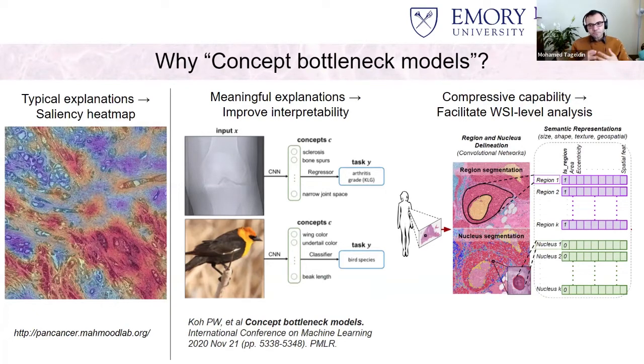But also, it's quite subjective. It's hard to know what really matters, and it's hard to know how to translate what pathologists subjectively consider when they're making these calls, when they're saying this is cancer because it has prominent nucleoli and it looks ugly and it has a feel that it's a cancer nucleus, or that there's variability in the tubule formation. A lot of these things, it's not immediately apparent that you can translate them to things you can detect yourself and be sure that this is the best way to measure it.